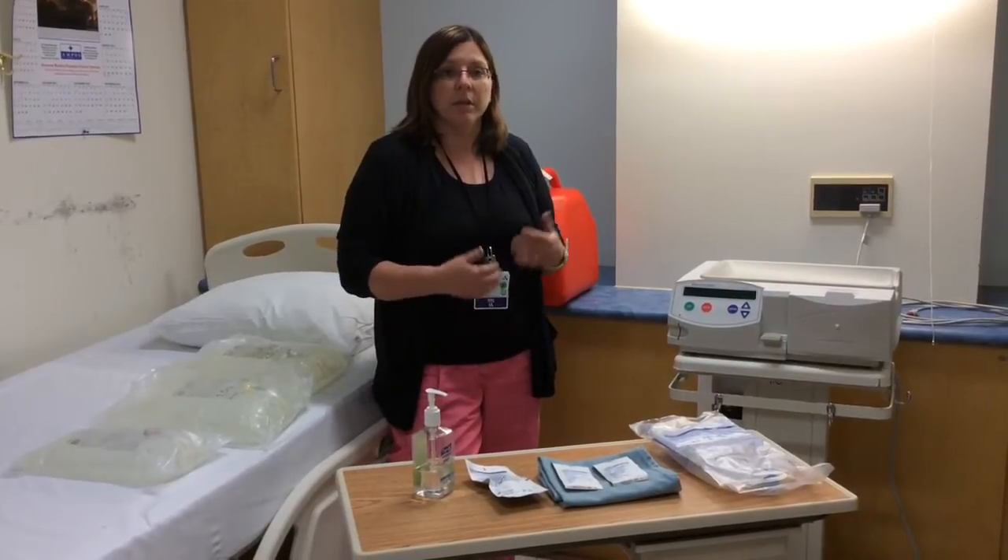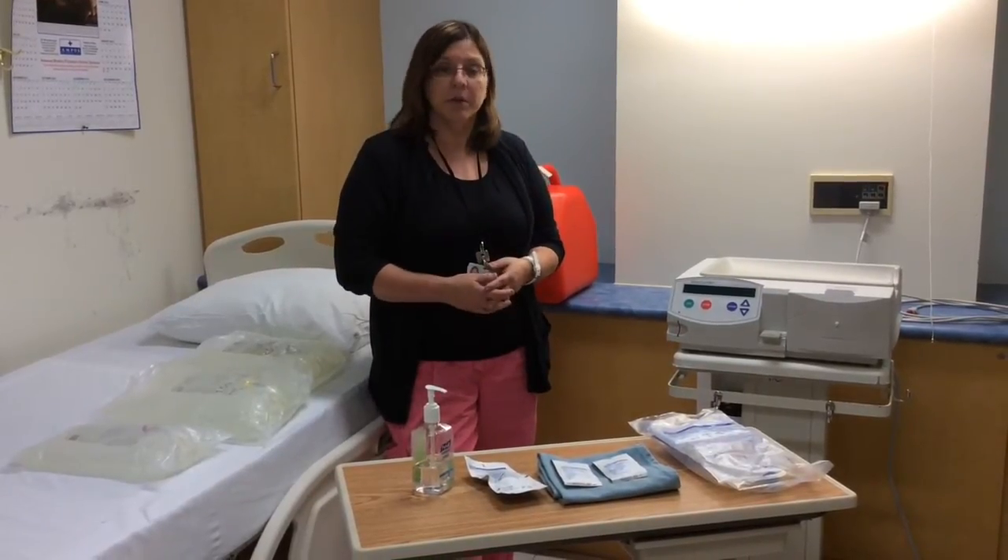Before you start, the most important thing is to wash your hands very well with soap and water.